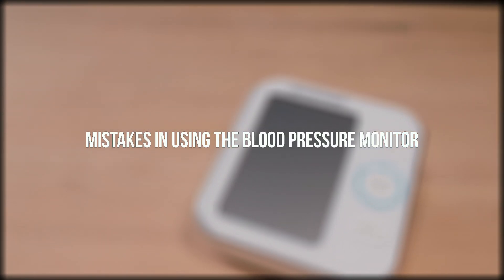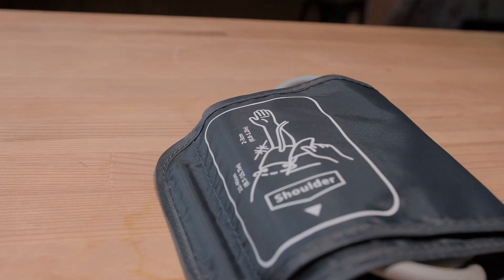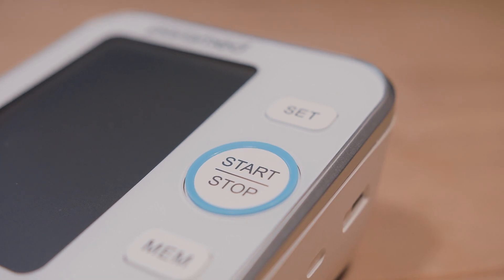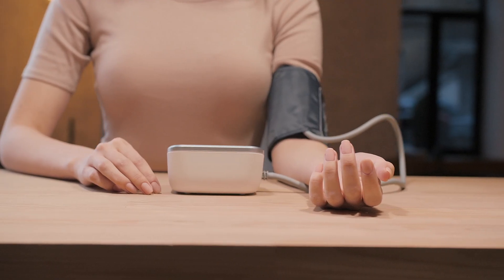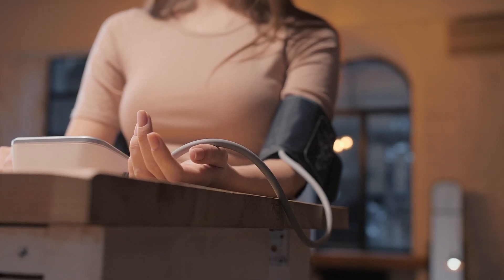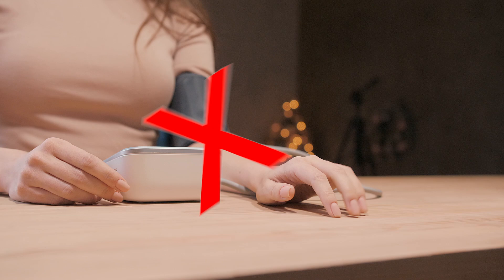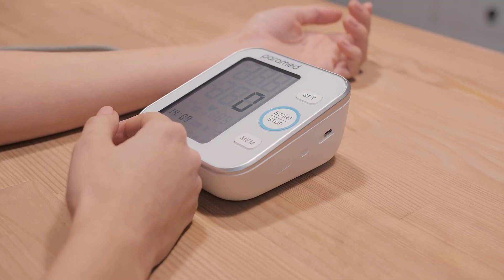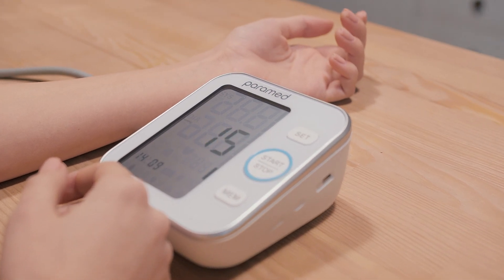5. Mistakes in Using the Blood Pressure Monitor. Pay attention to mistakes which can affect the measurement results. In order for your results to be as precise as possible, please do not do the following while measuring blood pressure: 1. Do not raise your hand or hold it in the air. 2. Do not turn your hand — your palm should not be facing down on the table. 3. Do not remove your arm from the table or put it down. 4. Do not move your arm. 5. Do not measure your blood pressure while lying down. 6. Do not measure blood pressure several times in a row without removing the cuff. Wait at least 5 minutes between intervals.